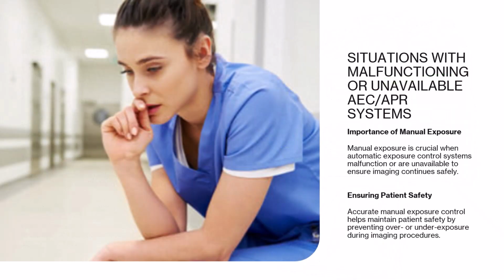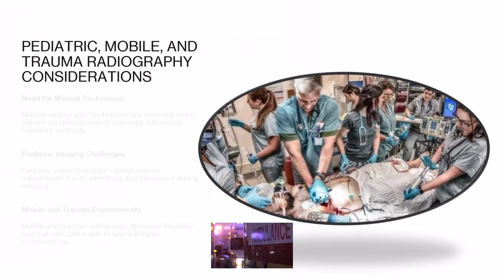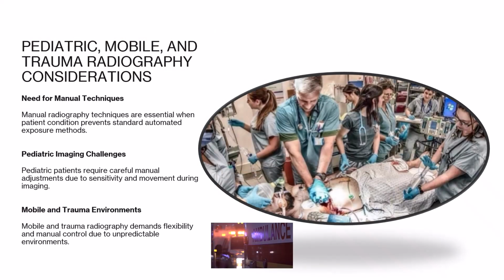When automatic systems fail or are not available, manual exposure becomes essential to continue imaging with accurate exposure control and patient safety. Manual techniques are often necessary in pediatric imaging and mobile or trauma settings, where patient condition and environment limit the use of automatic exposure controls.